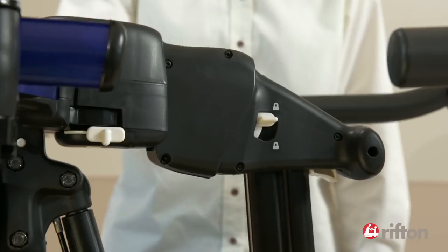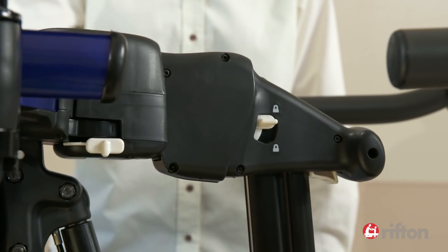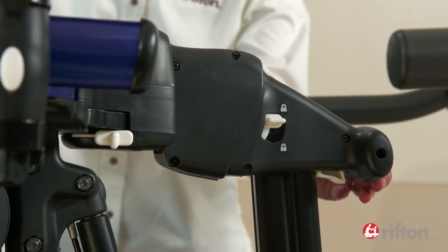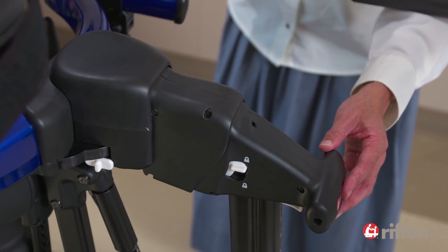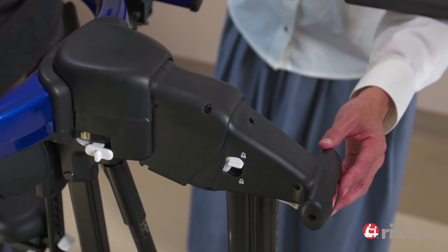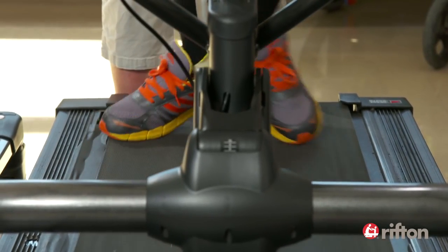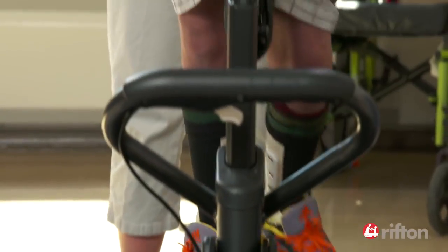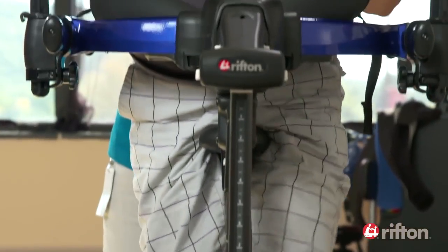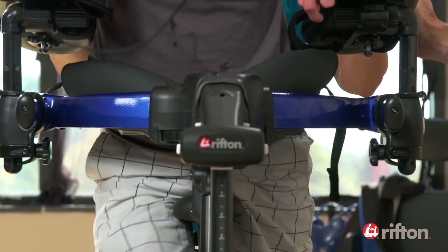The up and down movement allows Scott to move his center of gravity vertically and assist weight bearing, so that the opposite limb can swing through more easily. With practice, Scott will improve his ability to walk on a treadmill. This option enables him to do more walking at home, where space and opportunity for overground walking are very limited. On the treadmill, Scott can continue to increase his walking strength and endurance.